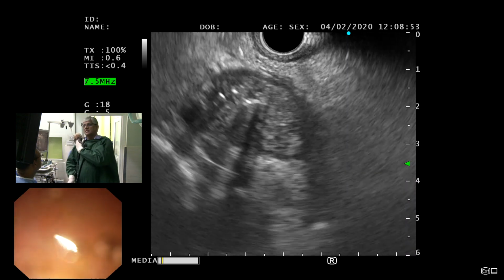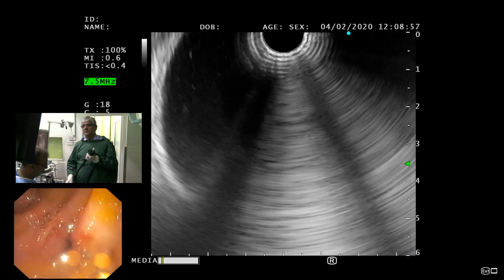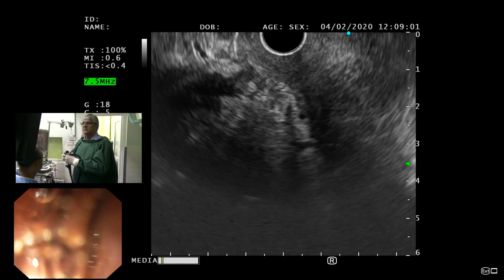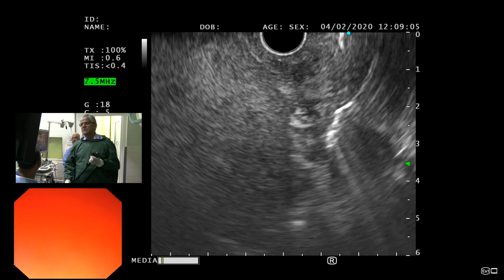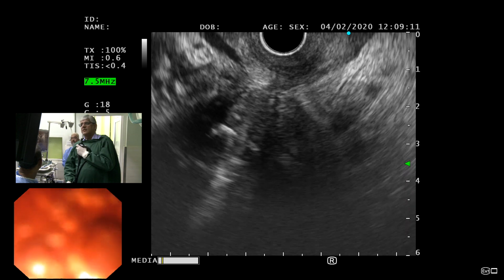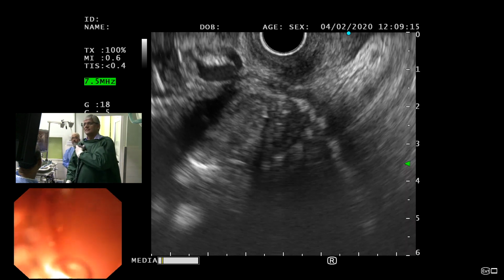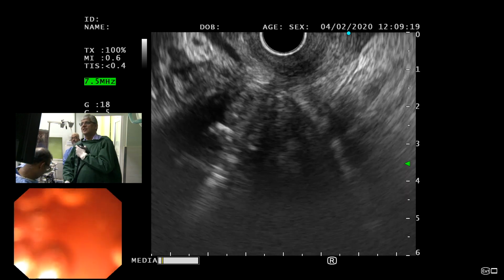22 gauge FNB? 22, please. Unlikely, this is not inflammatory.